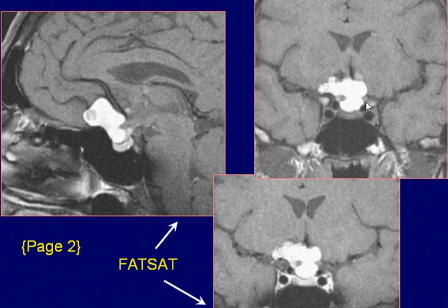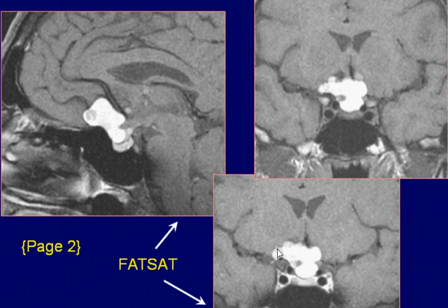Coronal pre- and post-contrast fat saturation T1-weighted images show the lesion as a hyperintense area in the supra-sellar region with extension to the adjacent cistern and posterior fossa. The right optic nerve is indenting the right side of the lesion.